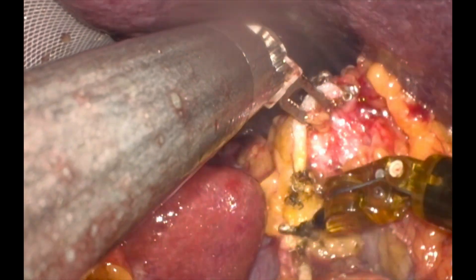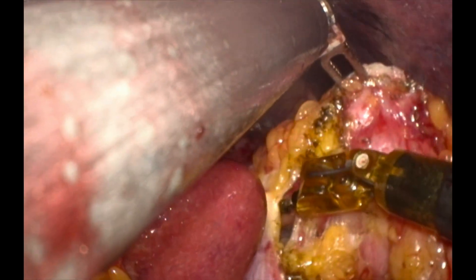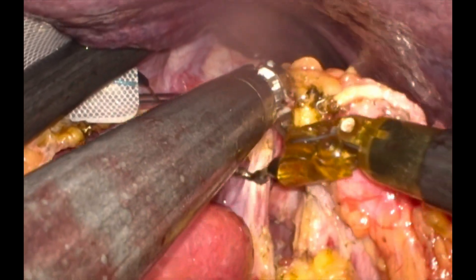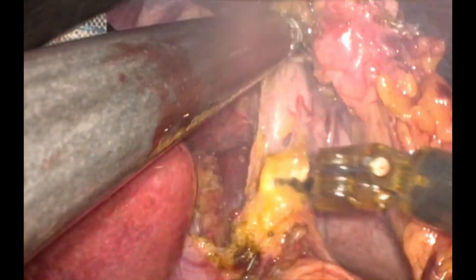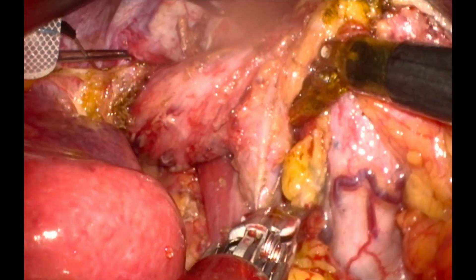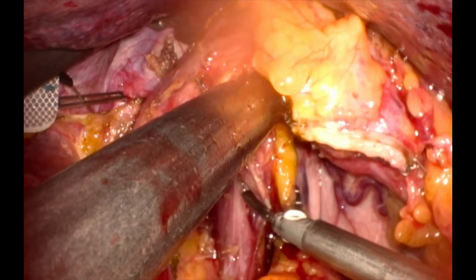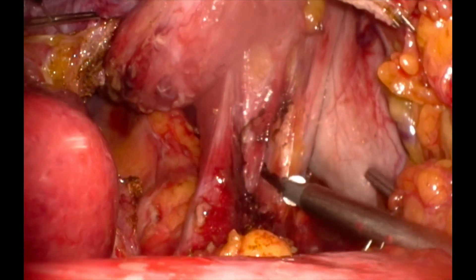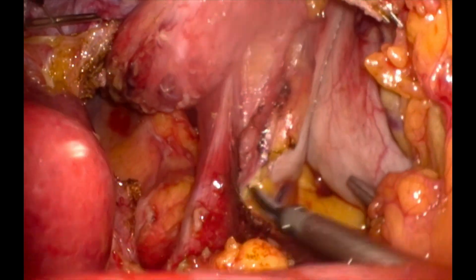Here you can see the caudate lobe of the liver to your left. Once the stomach is mobilized from the crus of the diaphragm and the G-junction is mobilized by dividing the phrenoesophageal membrane, the lower end of the vagus becomes free. The short gastric vessels can bleed as seen in this video. It is advised to use a harmonic device. With the harmonic you complete the dissection of the phrenoesophageal membrane as well as the small vessels. After this, the short gastric vessels arising from the splenic vessels going to the fundus and cardia are taken care of with the harmonic.